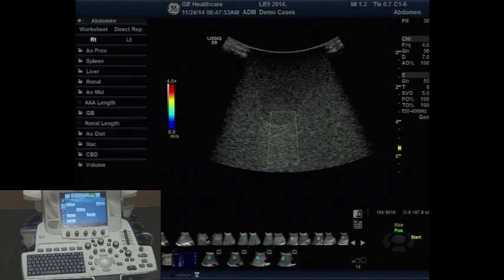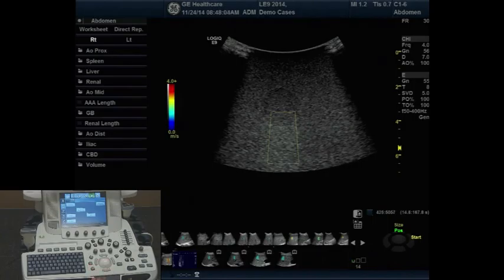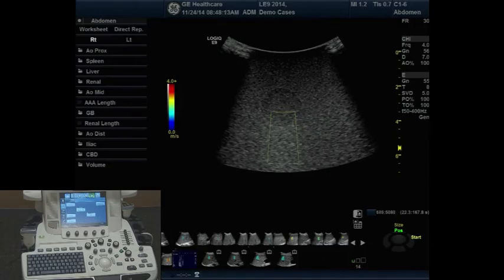wave elastography touch panel. Now you'll notice on the image display I have a normal B mode image with a region of interest defined. The region of interest is the yellow box outlined within the B mode image. This is what we call shear wave pre-mode.